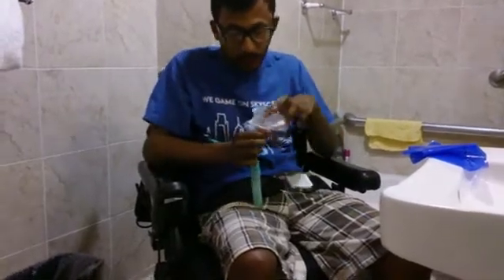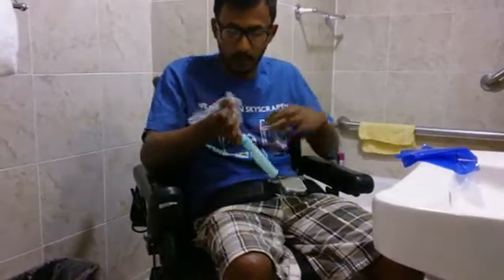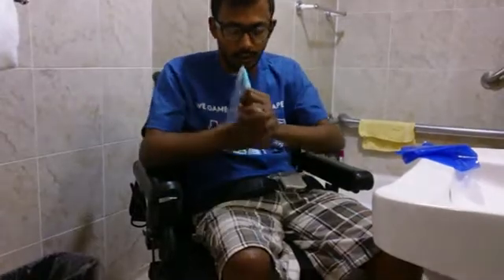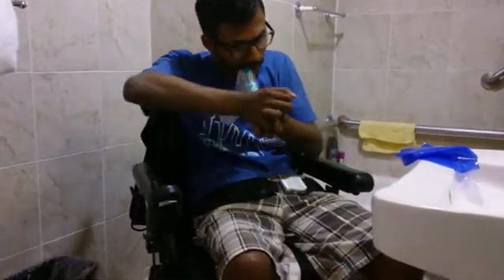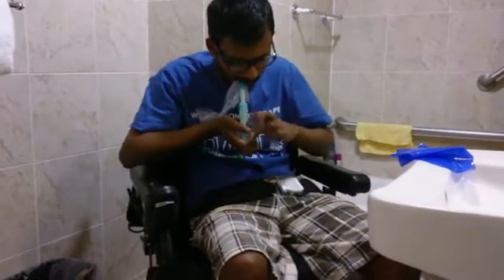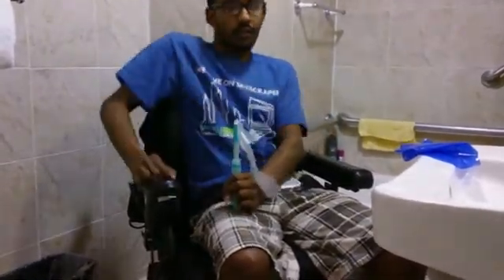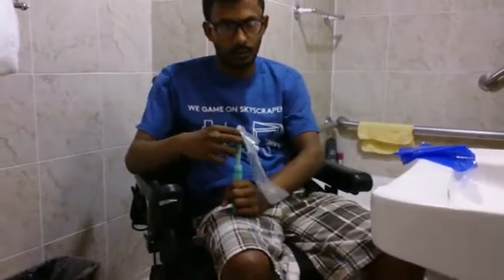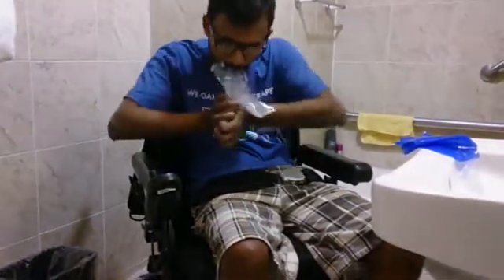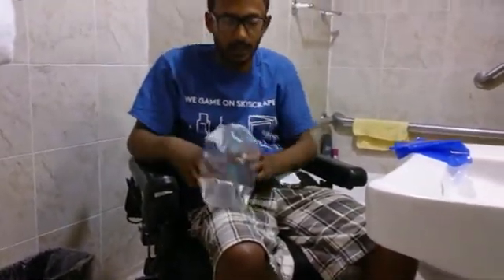There's a lot of teeth involved, but it's life of a quad. Once I get the bag open, all I have to do is kind of twist it open. I do not like to touch the tube with my hand, so that bacteria doesn't go inside me.